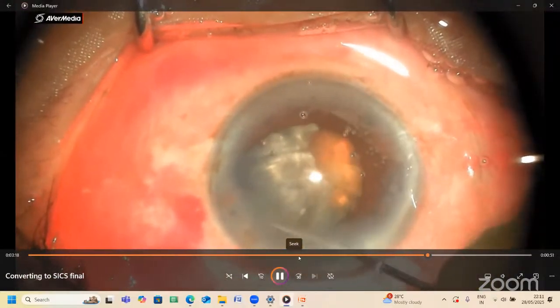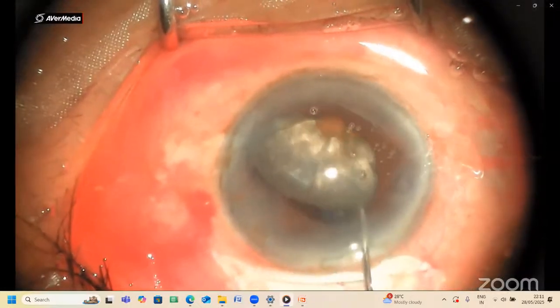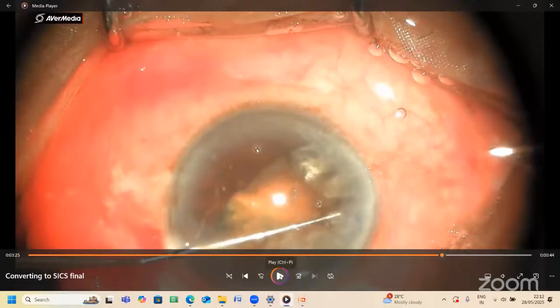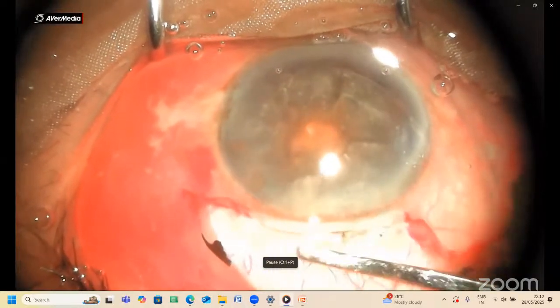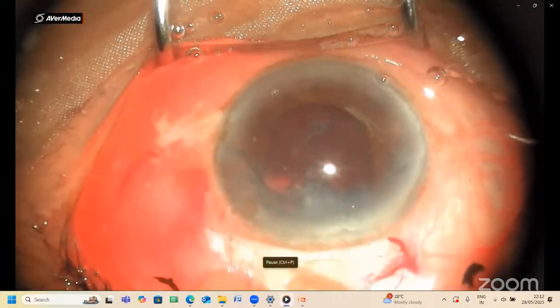After that, because I've had a rhexis extension, I consciously try to dial it first in one direction. I have brought it into the anterior chamber. I am worried at this point that I should not create an extension of the rhexis. So the tip is to inflate the anterior chamber, go behind the nucleus, inflate it, and also dial in the opposite direction so that you're not leading to a further extension of that rhexis. After having delivered it into the anterior chamber, I depress the nucleus, and as you can see, since it's in a deeper plane, it smoothly comes out of the anterior chamber.